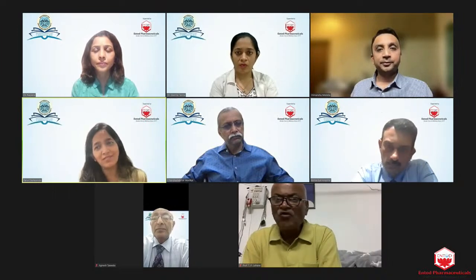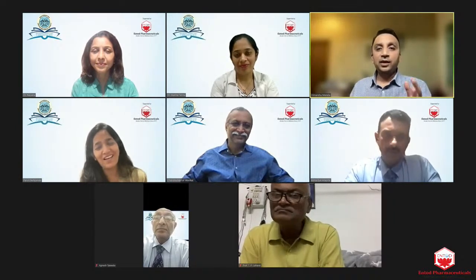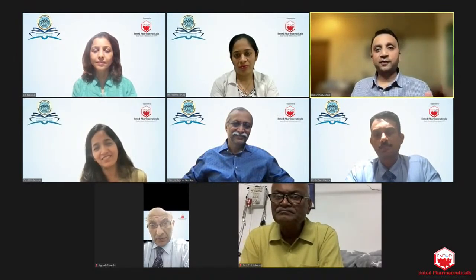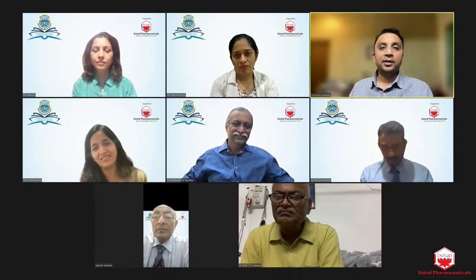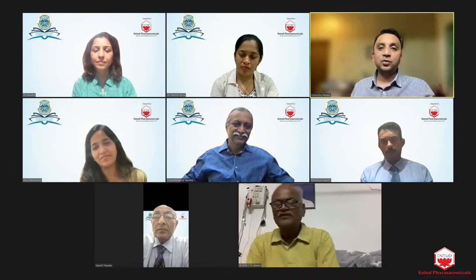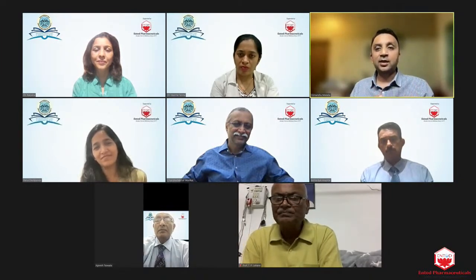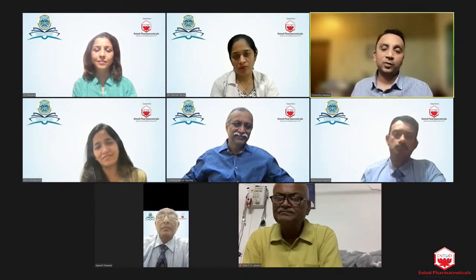So what about doing a DALK? The idea is that when we look at the cone, we decide whether it is a very advanced cone with an irregular surface. There's no point looking at any such thing. In that case, a DALK or PKP, whatever works best, would be the better choice. And if the cataract can wait, I would rather do a corneal transplant procedure first, wait for the surface to become regular, or at least give me an idea that I can get it more regular, and even if required, I can use a toric IOL or have a more predictable outcome.